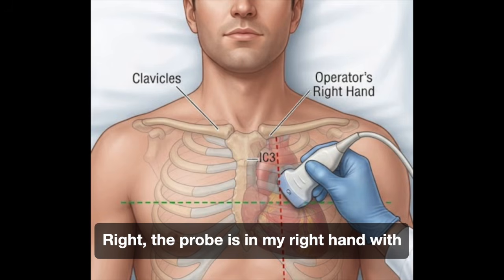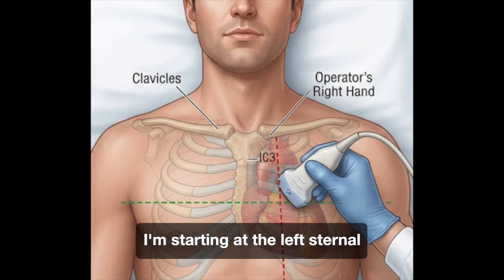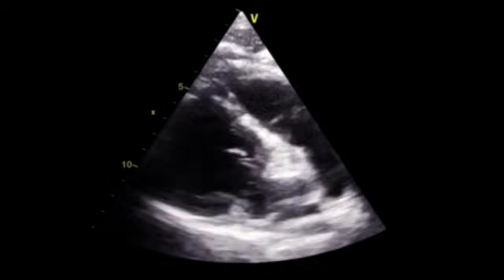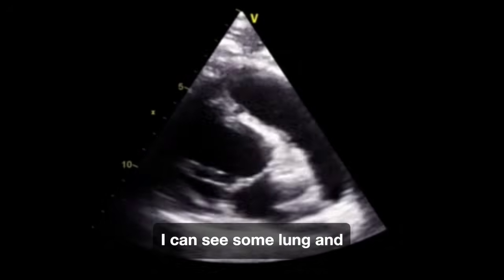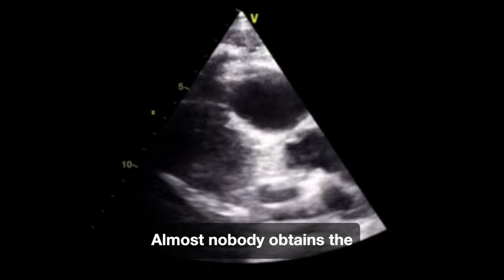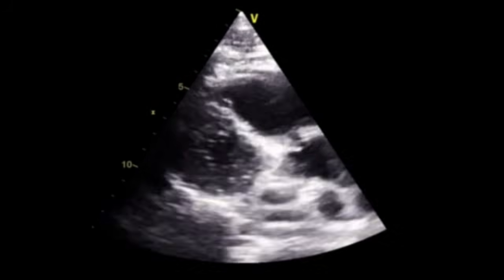Right, the probe is in my right hand with the marker pointing towards the patient's right shoulder. I'm starting at the left sternal border in the third intercostal space. Now watch the screen. Nothing useful yet. I can see some lung and part of a cardiac chamber. That is normal. Almost nobody obtains the perfect view with the first placement.